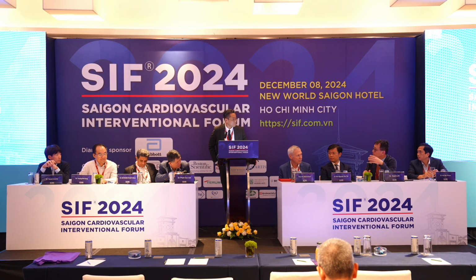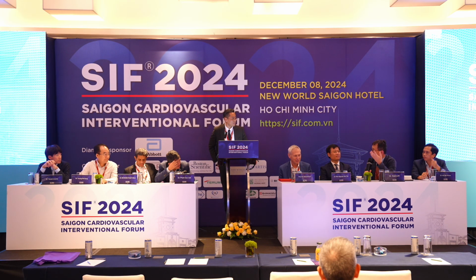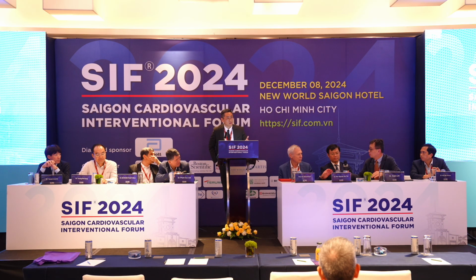Yeah. I've never seen a cutting balloon work under these circumstances before. It's either laser, lithotripsy or stent rotablation. I think at that time the operator worked in a private hospital. There is no option but to choose this scoring balloon to expand the stent, I think.